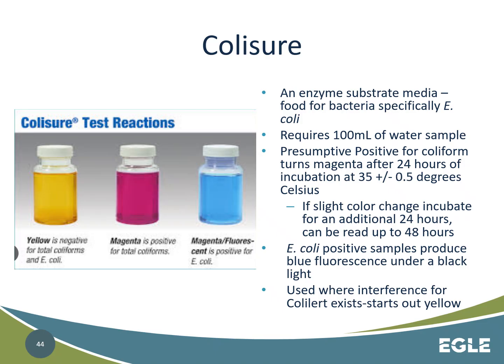to indicate if it has E. coli. So it's yellow with nothing, magenta if it's positive. That helps with the yellowing interference of iron that may be present in the water. And then blue fluorescence if it's positive for E. coli.